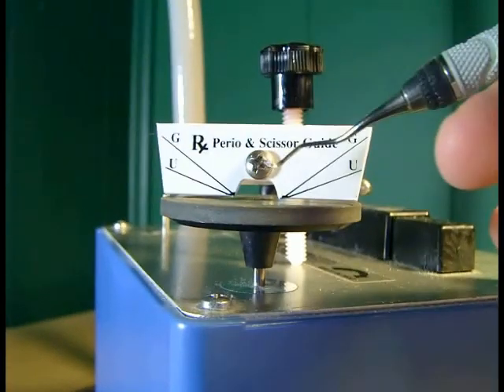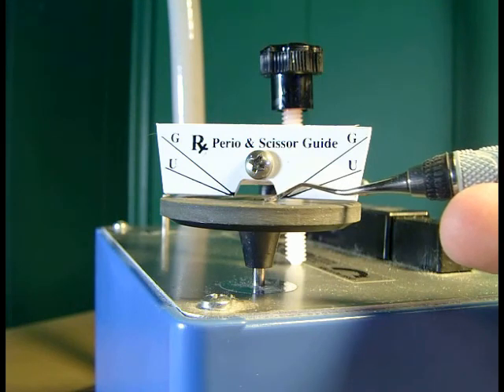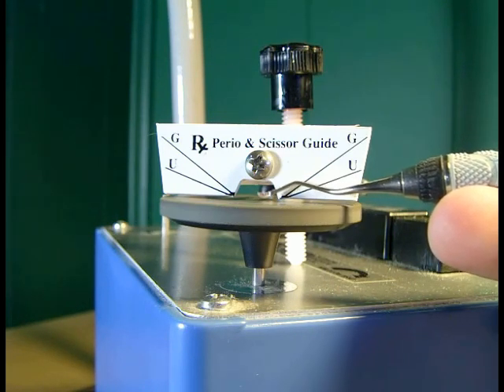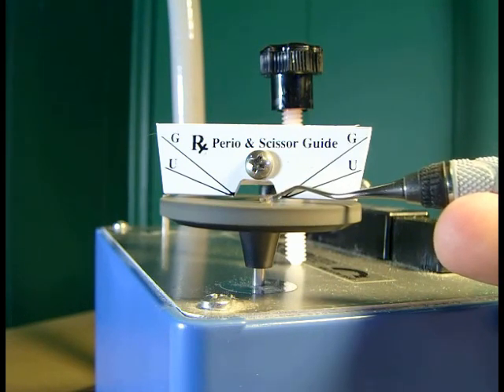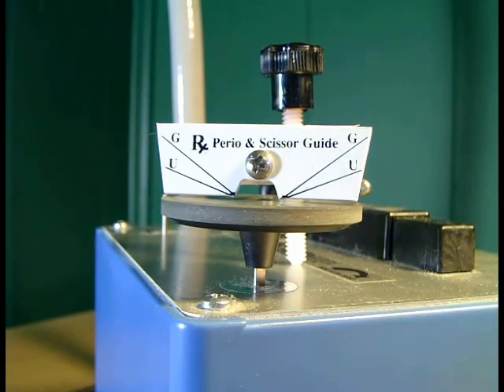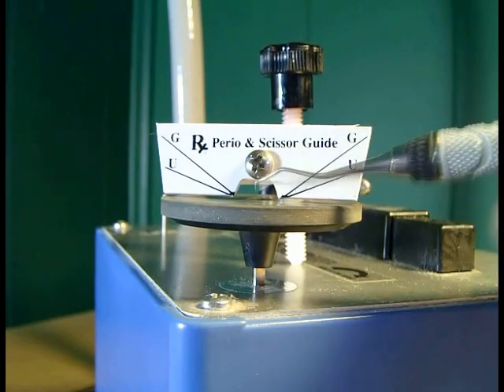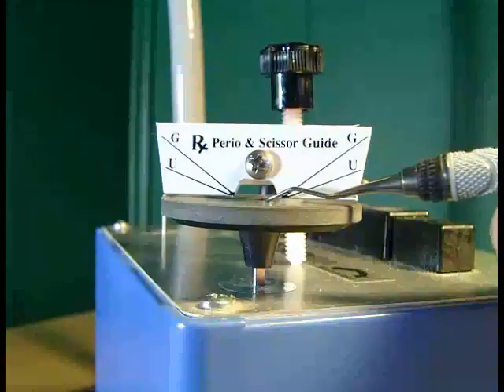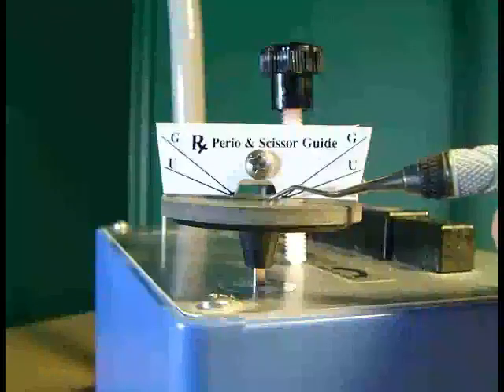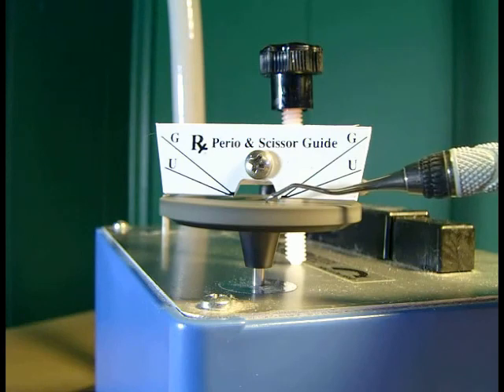Next up is the Gracey curette. Notice we're going to line the terminal shank up with the G line this time. Also, double check and make sure that you're sharpening the right side. Again, we're going to rock it from heel to toe, just like we did with the scaler. Now, just remember, even if you come off the line once you've started rocking it, all you're doing is following the blade, so that's not a problem.